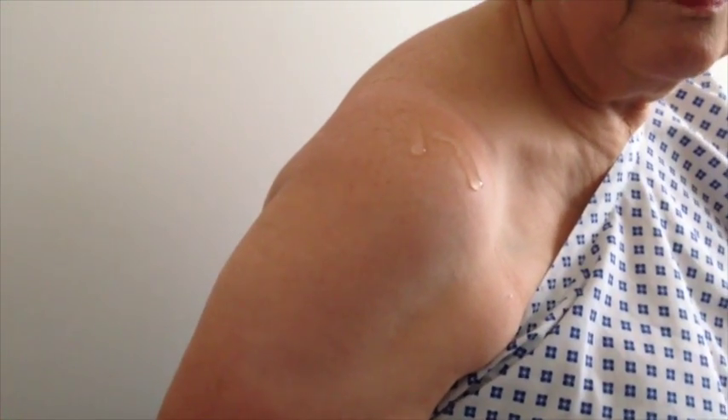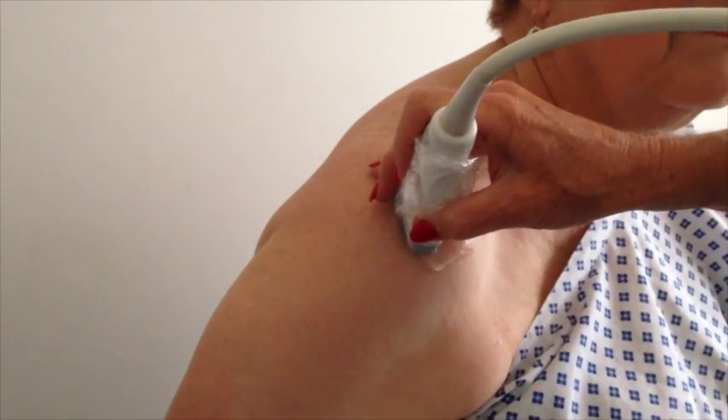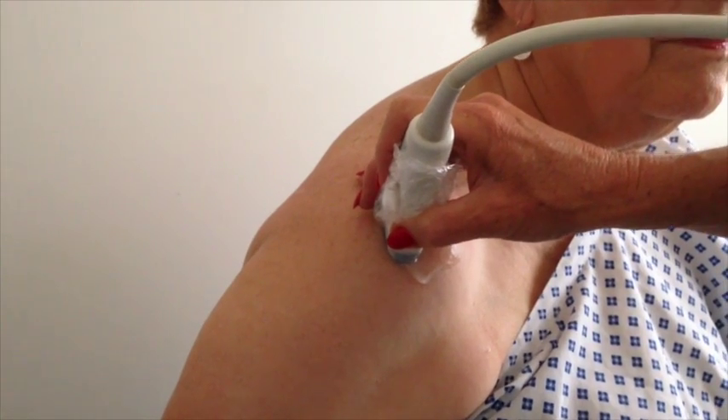Okay, so, Stephanie, what's happening is Lisa is actually now just going to find me a position. Right. And she's cleaned your shoulder. She's found me a position. You can see that on the screen.